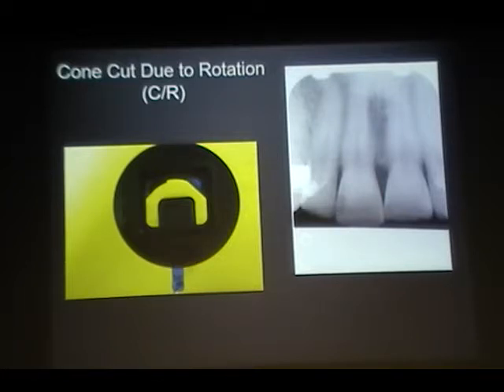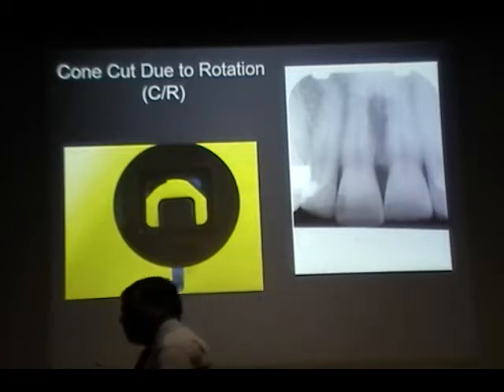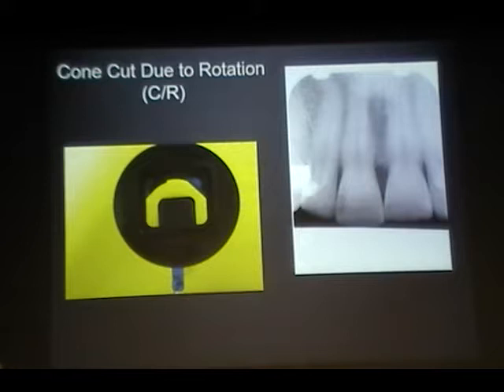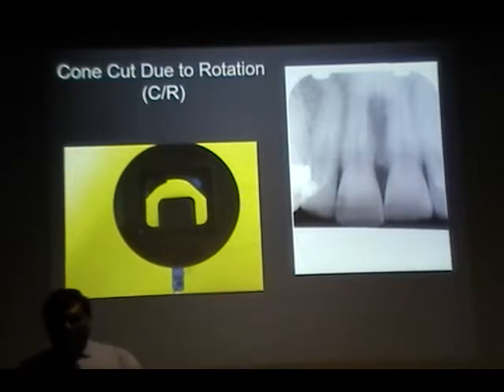If you're not familiar with this, don't worry at this point, because when you come down to the clinic, you're going to use it, and you'll come to know what I'm trying to say. Right? Collimator is basically, imagine this is your collimator. So if you want to capture the posterior teeth, you should be placing it like this. For anteriors, because they are like this, you'll flip the collimator like this, so that you can capture. Make sense?